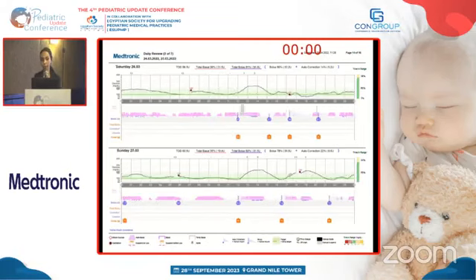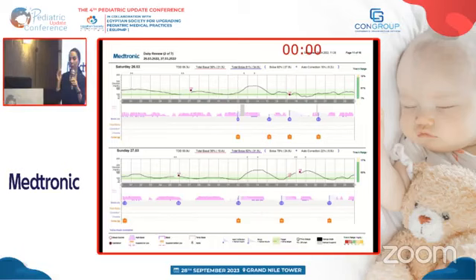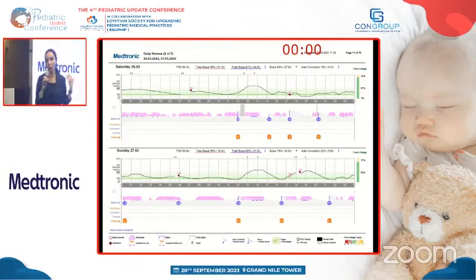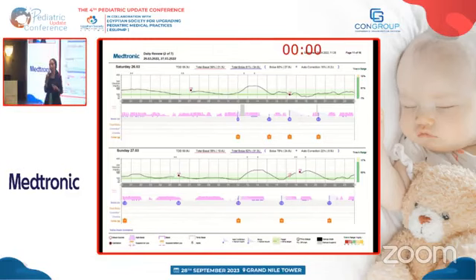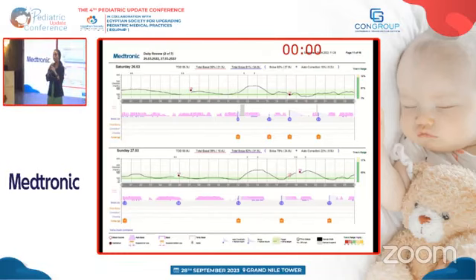اوكي طيب فهنا لما ببص على الريبورت داي باي داي ده بس تو كونفيرم لنفسي ايه الريزن اللي عامل لي، مع ان لو نفتكر هو اصلا التايم رينج بتاعه هو 83، فاحنا من الاساس لو شفناها هنقول يو ار ويل كنترولد مش محتاجين نعمل حاجه، بس دي ميزه ان انا اعمل اناليسز للكيس بتاعتي وابص فيها داي باي داي، فهلاقي نفسي ان انا ببيك حاجات، وايفن لو الحاجات دي بسيطه.